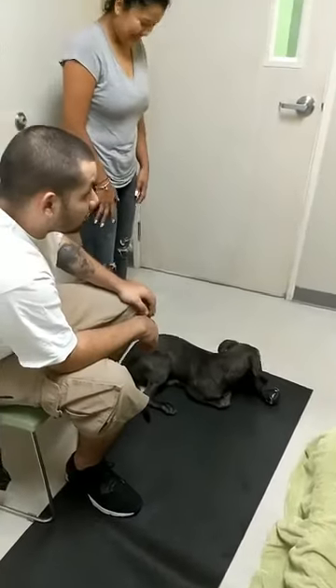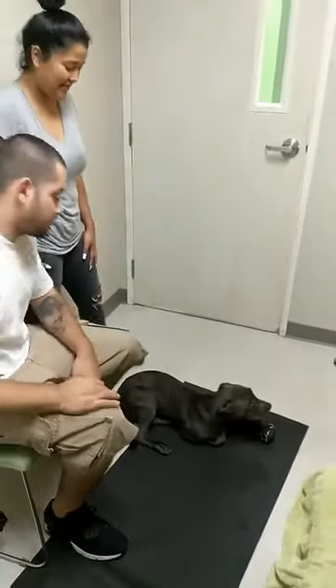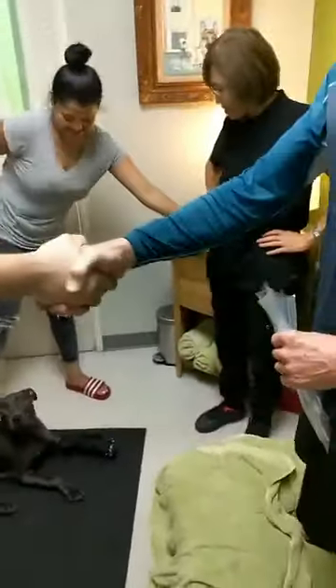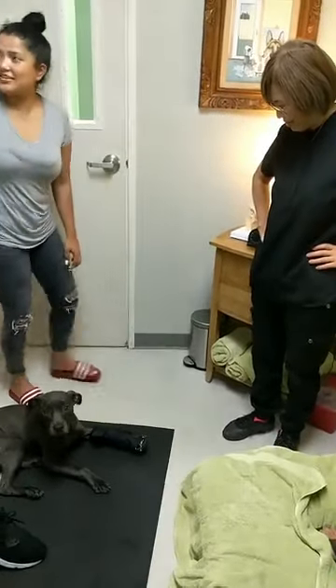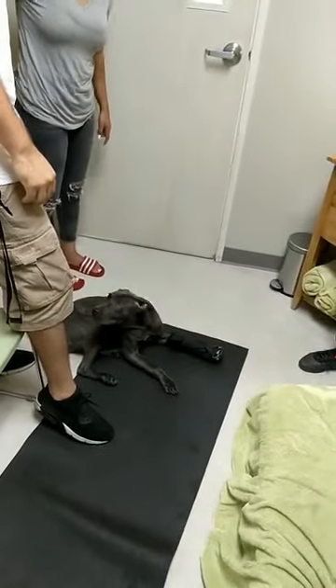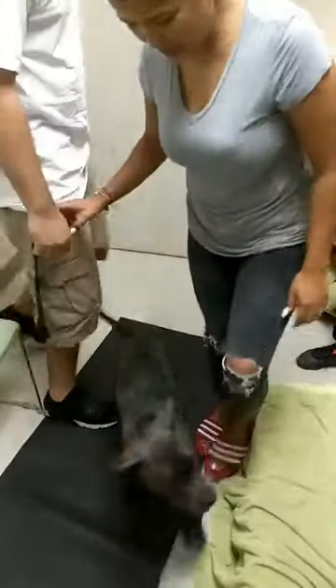Good job! Okay, we're ready to go. Thank you, thank you — you're ready! Come on, let's go. Good boy, there you go. He's using it the right way, so that's good.